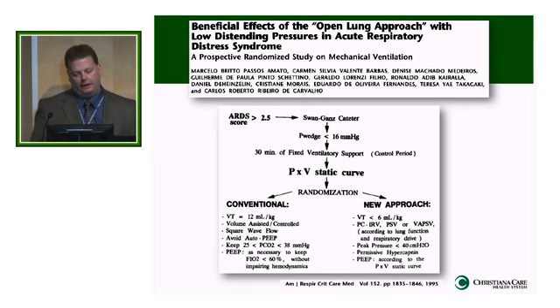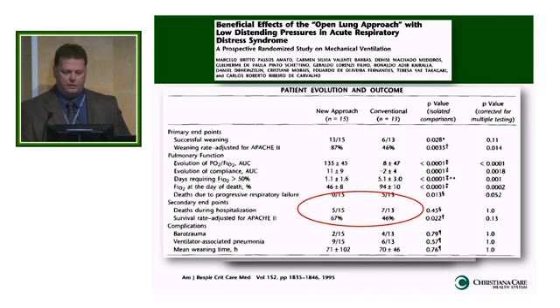And what did they find? Again, it's a small study. It was published in the Blue Journal. I'm just going to show you a few different values. This is total PEEP. This is that newer open lung approach. PEEP was much higher than the conventional approach.